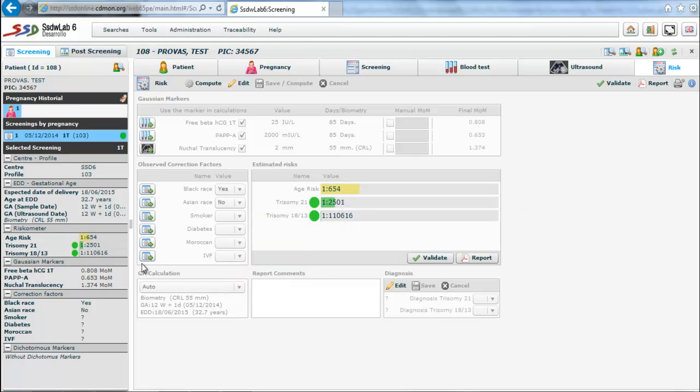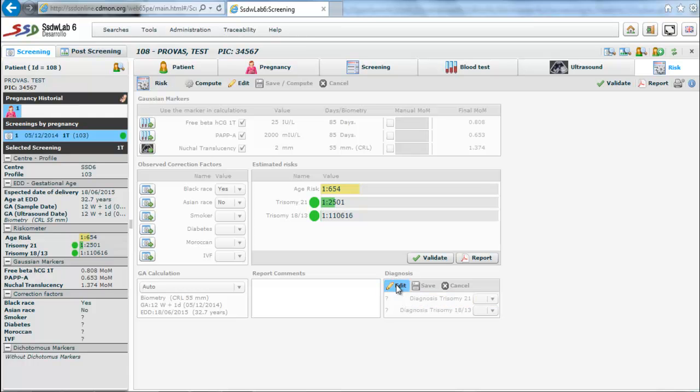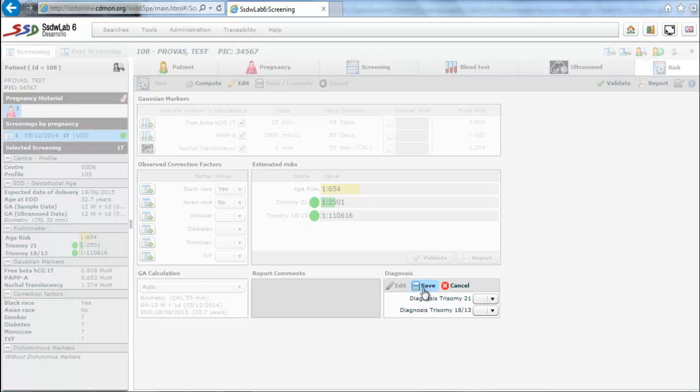In the bottom left of the screen there is information relating to gestational age estimation. In the bottom center there is a box that lets you enter details that will appear in the report. And in the bottom right there is a section that, after completing the relevant tests, we may introduce the diagnostic values for both trisomy 21 and trisomy 18/13.